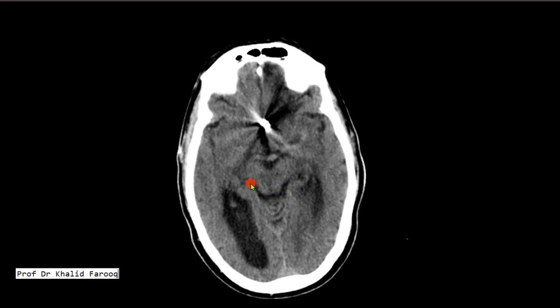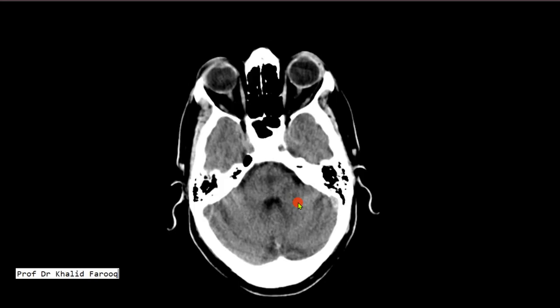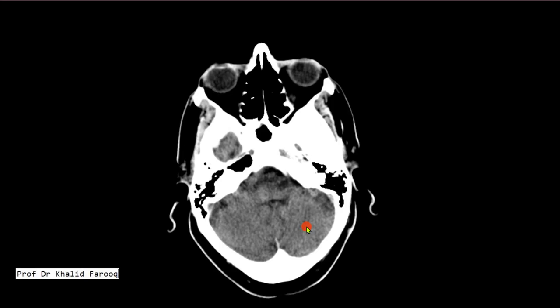The visible structures include the midbrain, quadrigeminal cistern, middle cerebellar peduncles, fourth ventricle, pons, cerebellum, and cerebellar vermis.